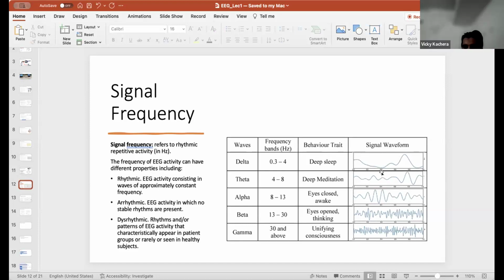Very complicated. But you can imagine that this curve here is made of 250 data points. There's a dot here. This is when you measured the data. That's called the sampling rate. For the 1 second, if I only took measurement for 1 second, I will have data at 0.00 whatever, and then like that. So many data, I'll have 250 data points that will make up this curve. And then when I visually see it, I see 1 or 2 peaks. So I'll say, okay, the frequency is around 2.